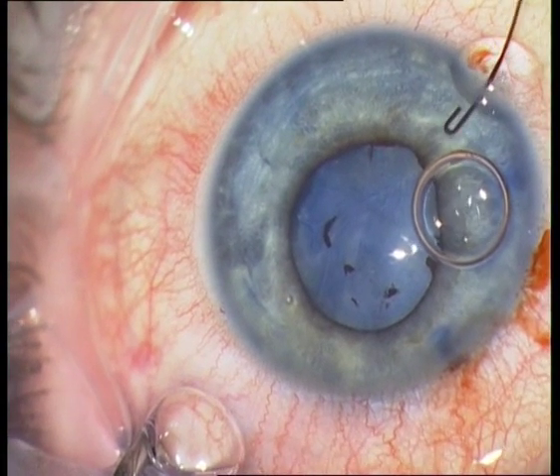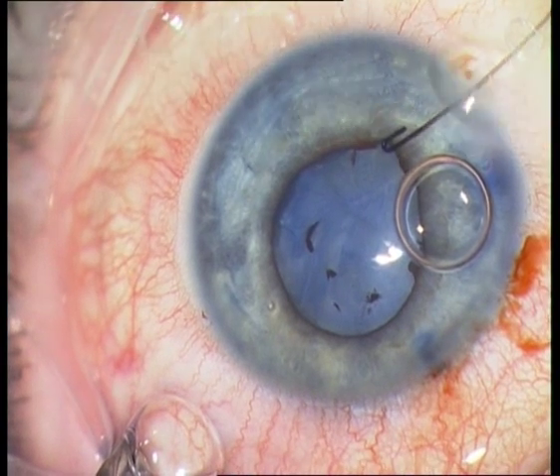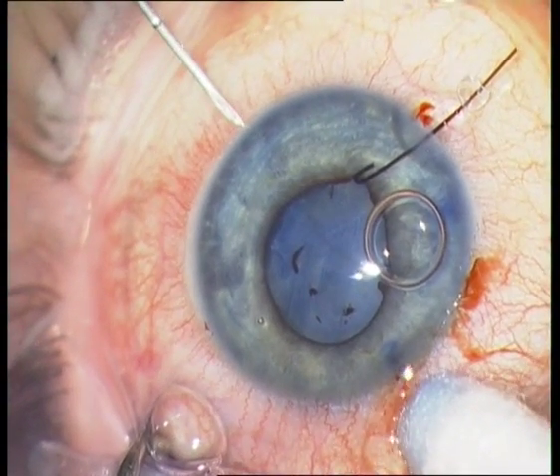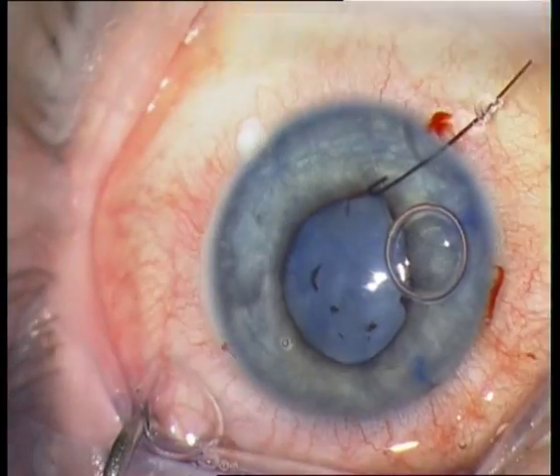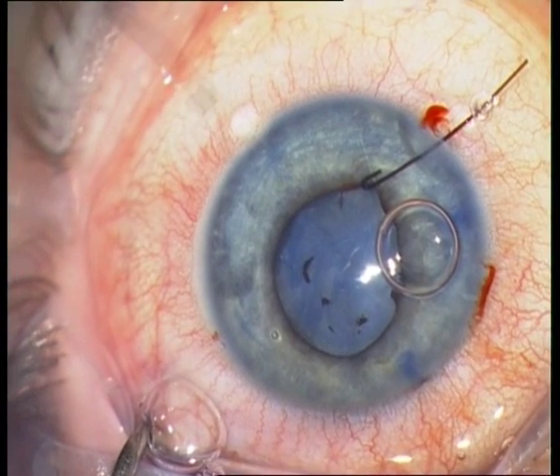I therefore continue with the insertion of iris hooks to dilate the pupil. I am using a 27-gauge gray cannula for the incision, then insertion of the iris hook.